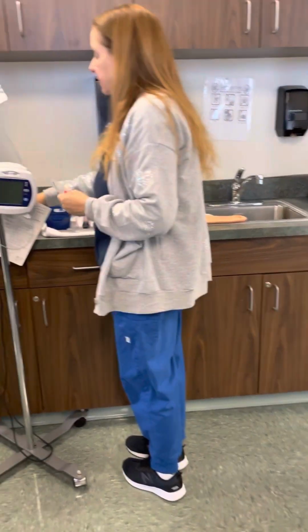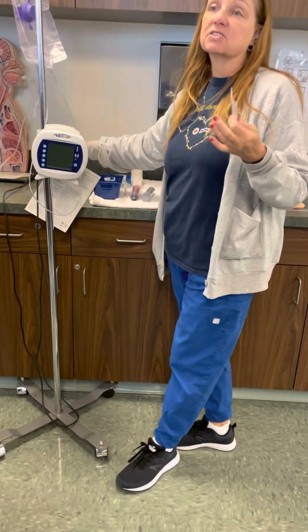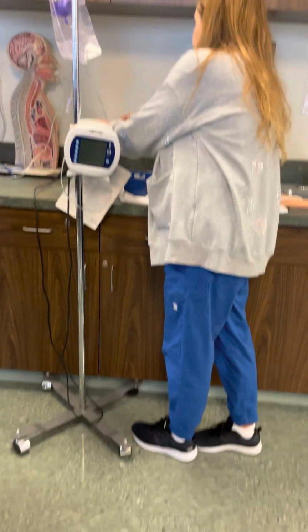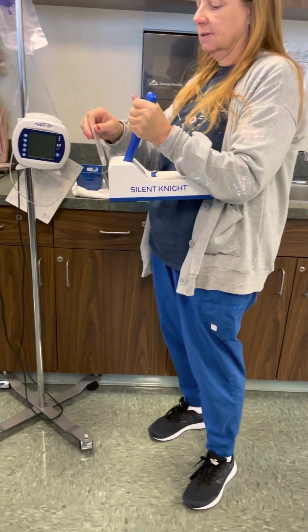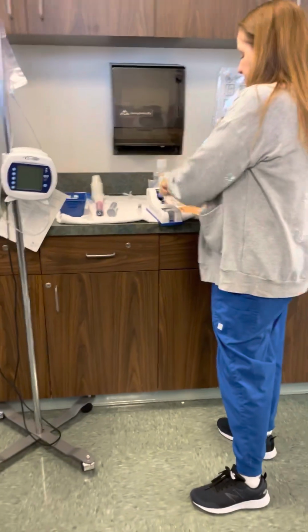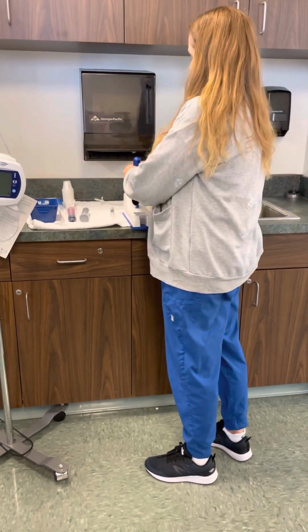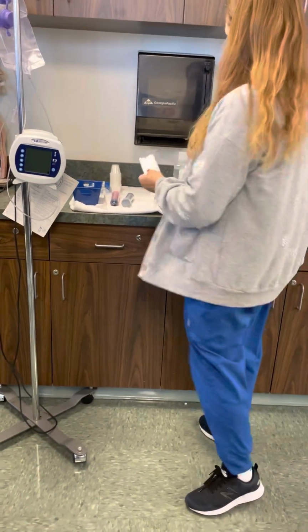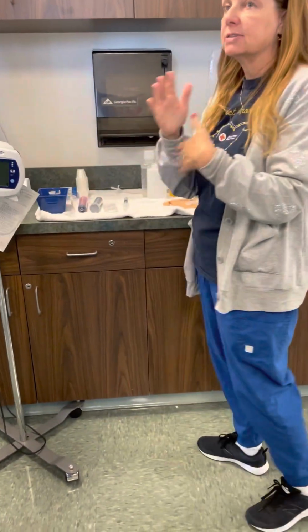Okay, so what you're going to do is you're going to crush it. A lot of units will have these. I've been on some units where they just have a hard rock that they use to crush the med, but this is a professional type crusher. See this little pocket here? You stick that in there, and you put it on a flat surface. Okay, and now it's nice and crushed. Did I do a good job, Rebecca? Yeah. Okay, so I would do all of that before I go back to the patient's room. I would get all the meds ready.